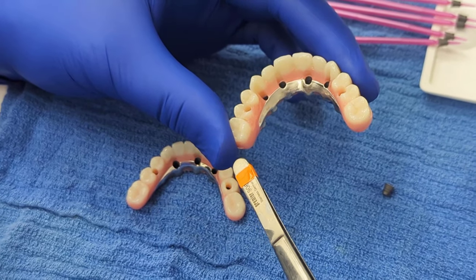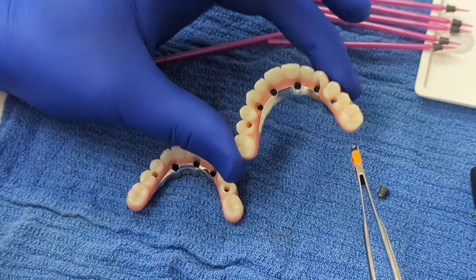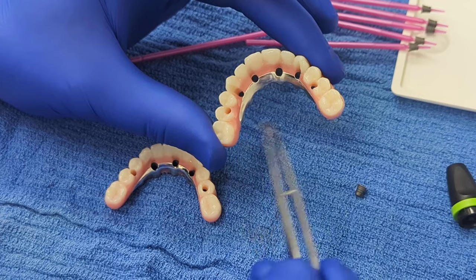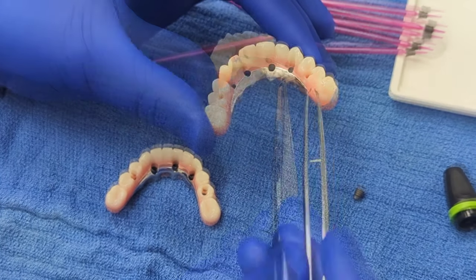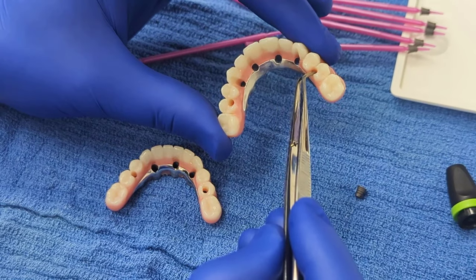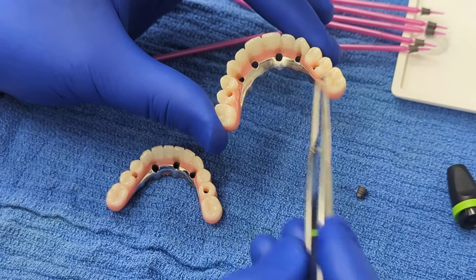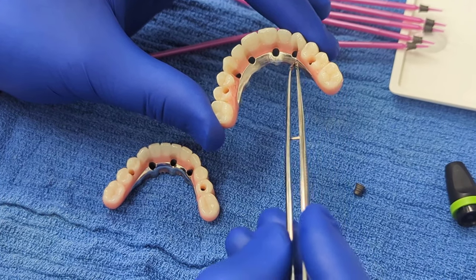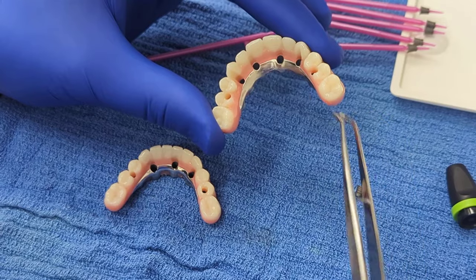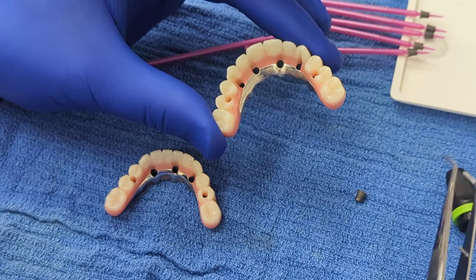as much as possible. And at the same time, although this case doesn't show it, this case has a not quite a two-tooth cantilever, but we can cantilever 2 to 2.5 teeth. So even if this last implant was in this first premolar area, we could cantilever all the way to the first molar, not have to worry about sinus augmentation or sinus grafting, get the patient 12 teeth, keeping things nice and simple.